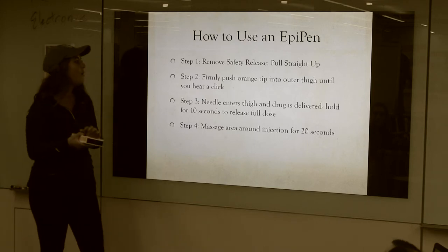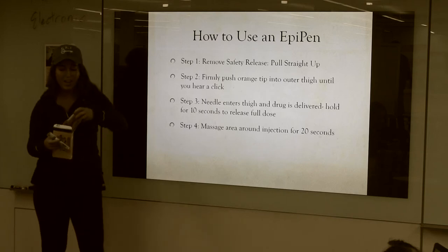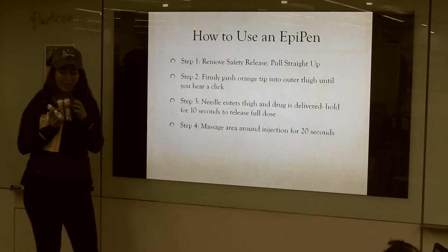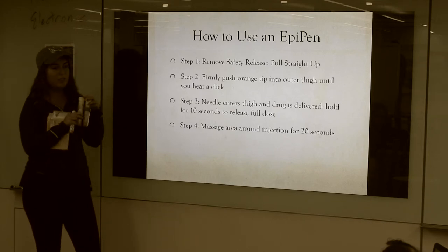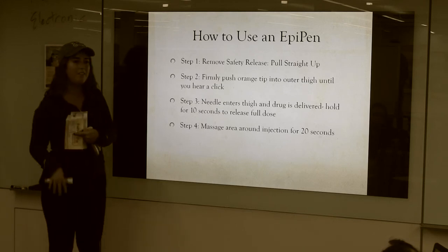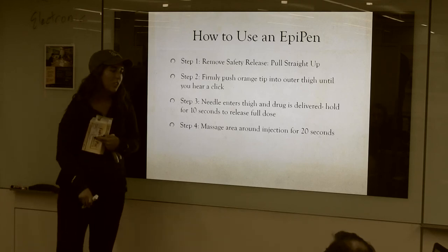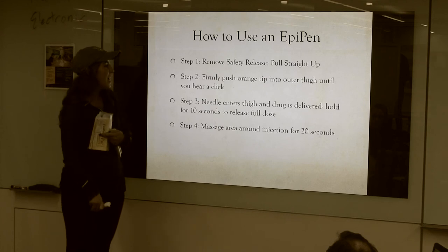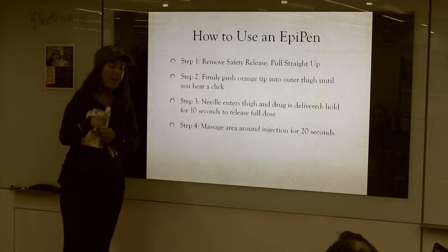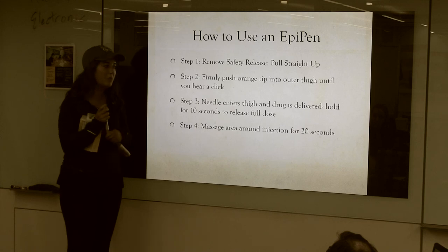How to use this? It's pretty simple. I'm just going to use the tester one because I don't want to actually shoot myself, but this is what they look like, and you'll always know that the needle is wherever the orange area is. Basically, you just remove the orange cap, and then you want to insert it into the fattest part of your thigh. You're going to firmly push until you hear a click, and then you hold it in for about 10 seconds to release the full dose, and then you can release it and massage the area around the injection to make sure the full dose is released.